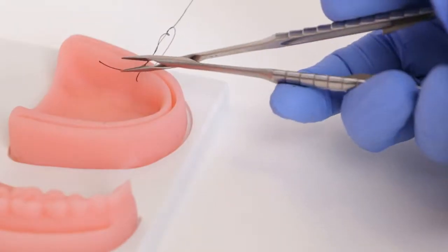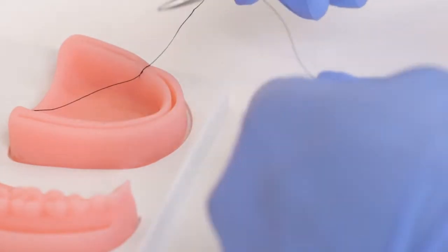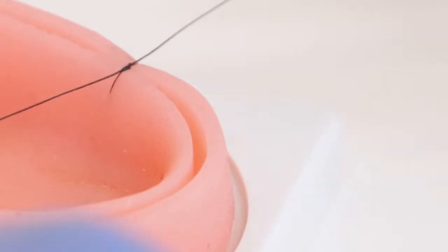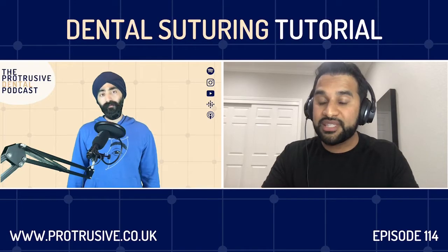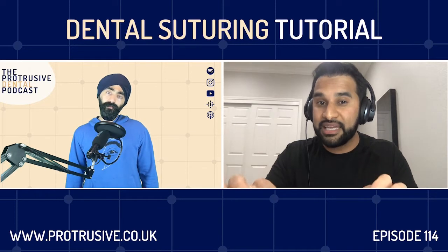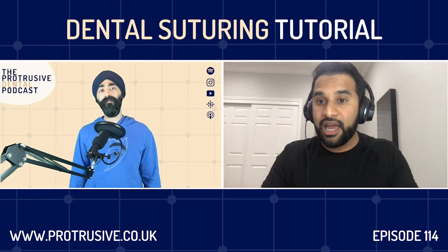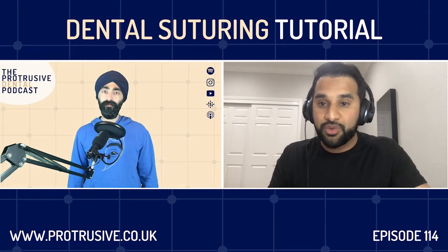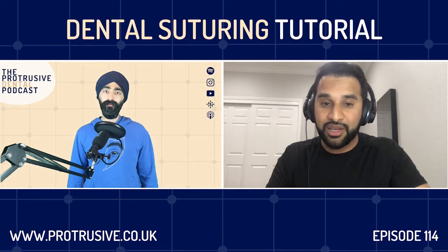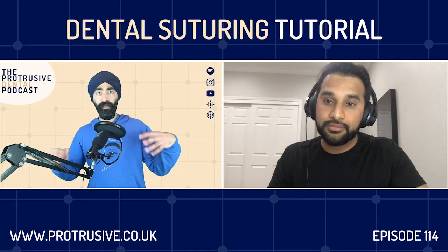But what you want to see is when you do your first throw, you want to see those threads lay down nice and flat against the tissue, not with a lot of tension, because you don't need a lot of tension. But you want to see that first throw lay down flat. And then when the second throw comes down, you want to see it lay neatly on top of the first throw. Just locks it in. And then you add on a couple extra just to secure the knot. But it doesn't have to close with a lot of tension. The knot just has to lay down flat against the tissues. So it's lay it flat, but no blanching.